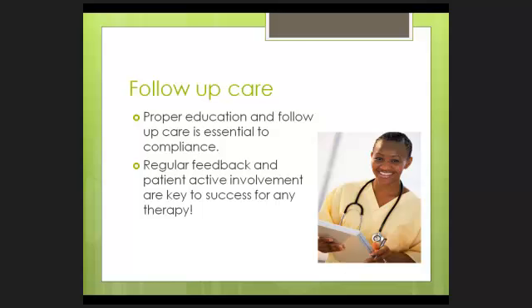Proper education and follow-up care is the most important and essential component for good compliance of any therapy. Most healthcare providers will offer a combination of follow-up care strategies: phone calls, face-to-face meetings, or even handouts. Handouts may cover CPAP therapy and may list common misconceptions that CPAP can be used intermittently or is not needed for naps. Some handouts may describe the benefits of CPAP or troubleshooting techniques for problems.